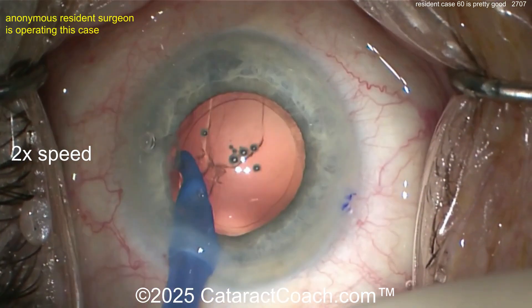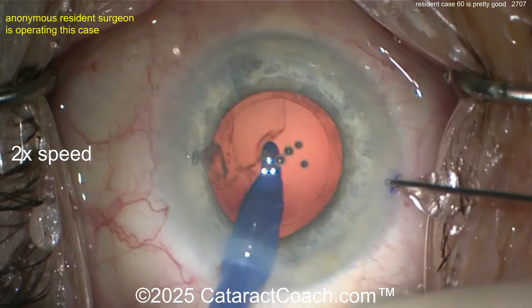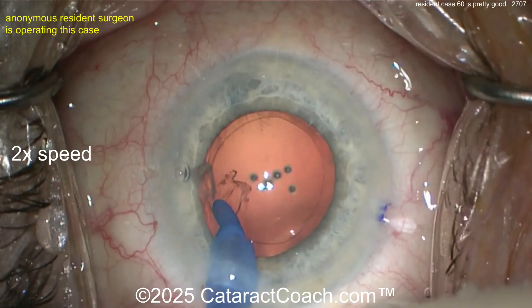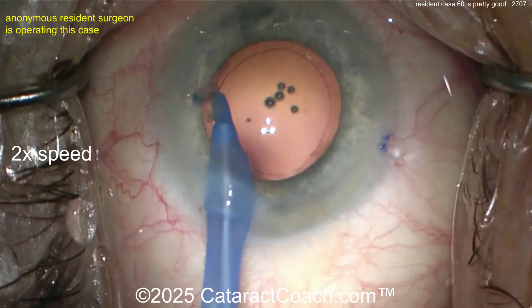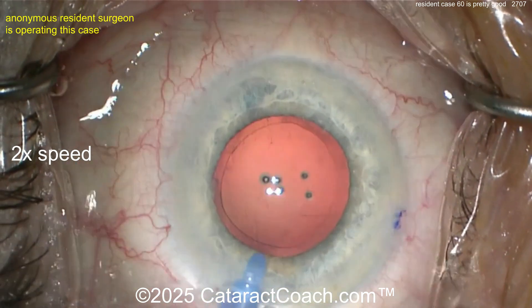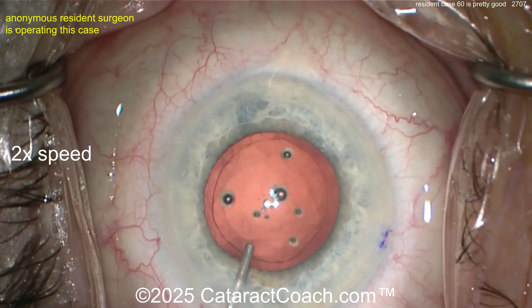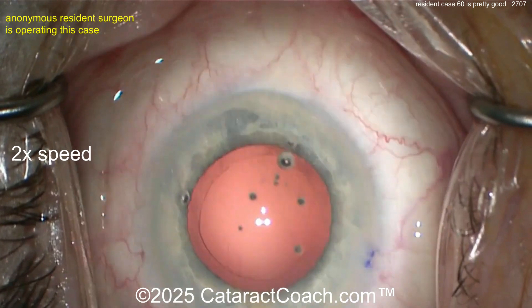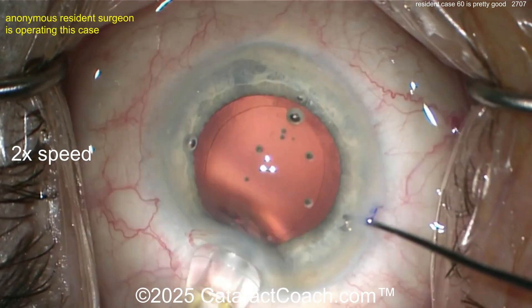For case 60, that's really good — but be your own toughest critic. Maybe start challenging yourself with a newer technique. It's time to move to stop and chop. You can't do divide and conquer forever — you've got to learn everything. By the way, the onus is on you as a resident to make a list of things you want to learn: like a Yamane, a pupil expansion technique — make a list. Then work with your attendings, professors, and consultants to find appropriate cases so you can learn these during your training.